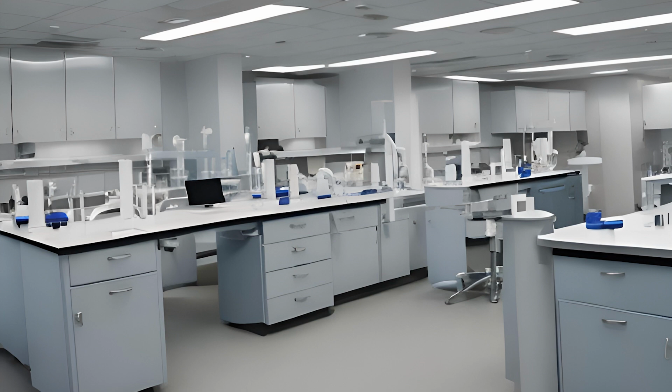Once you're done labeling your tubes with the pre-printed labels, you're going to write the date, the time, your initials, and any other pertinent information on the label immediately prior to or immediately after you attach the label to the tube. You're going to label that tube in front of your patient, and you will never label the tube before you draw someone's blood.